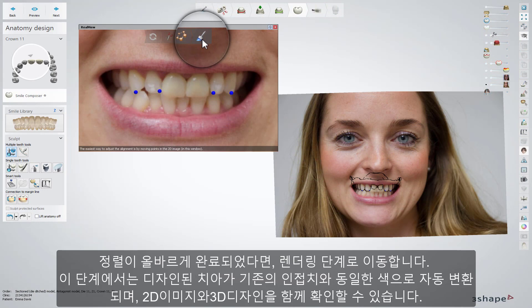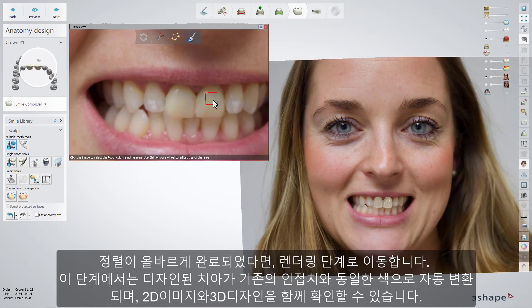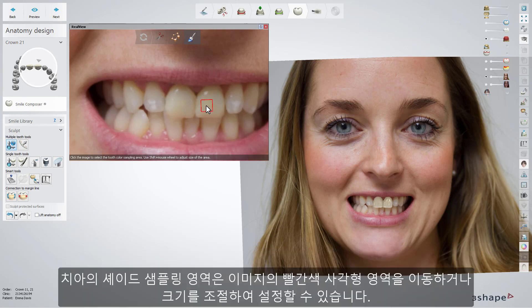When alignment is correct, go to the rendering step and view the 3D design together with the 2D image, where the CAD design teeth are automatically rendered with the same colour as the existing neighbouring teeth. You can change the tooth colour sampling area by moving the red square on the picture as well as by changing its size.